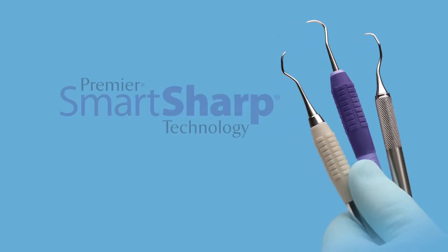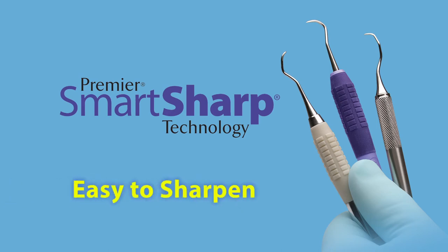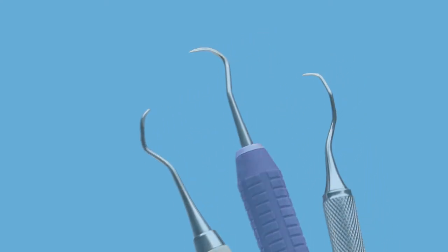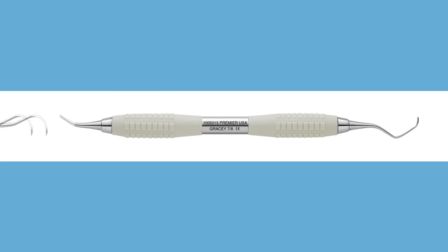Premier utilizes SmartSharp technology, a proprietary process for well-defined edges that are easy to sharpen. Premier instruments are available in a wide variety of handles: Light Touch, Big Easy, and Big Easy Ultralight.